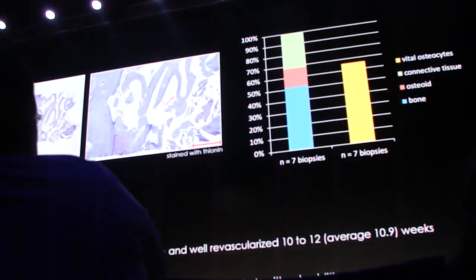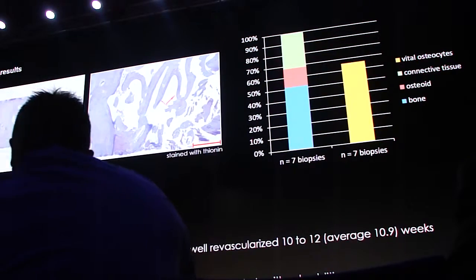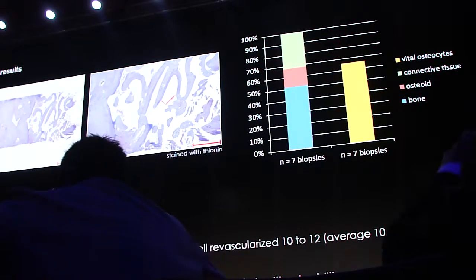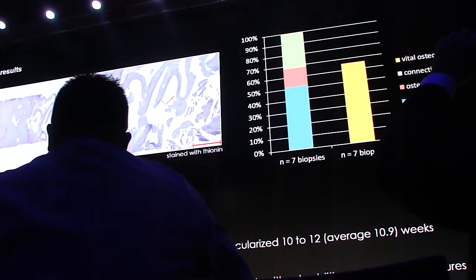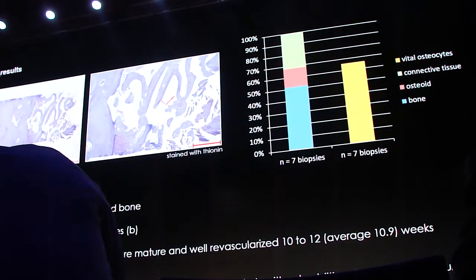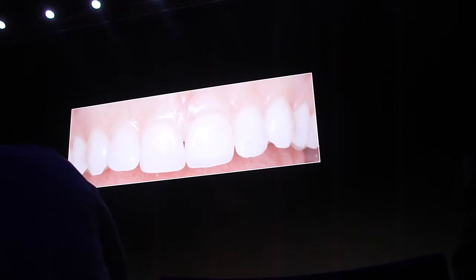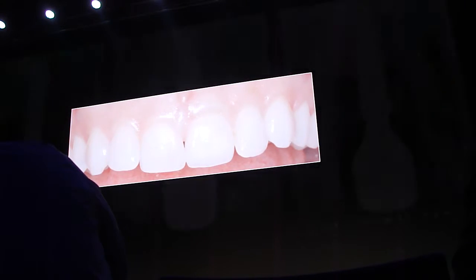So the biopsy from the grafted area, taken 10 weeks after the grafting process, shows us that large parts of the bone graft had already been revitalized, which is very important for long-term tissue stability. So the picture showing the clinical situation 5 years after the implant prosthetic situation still shows a very stable clinical situation. But what about the radiograph?